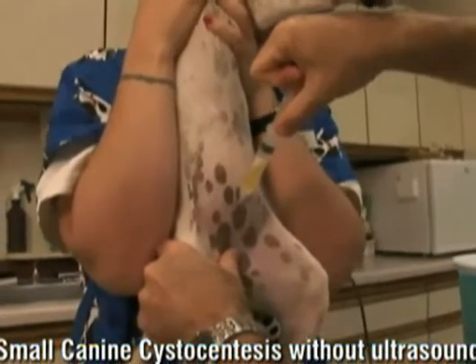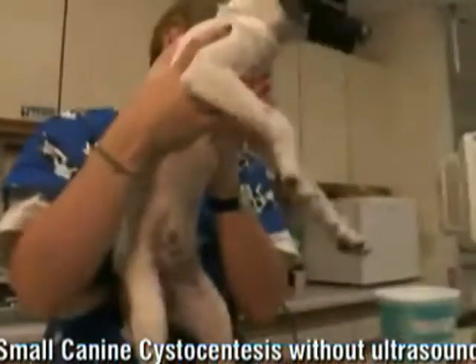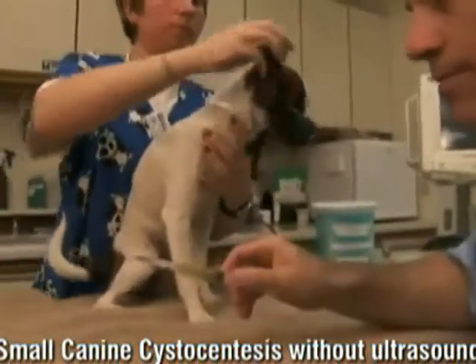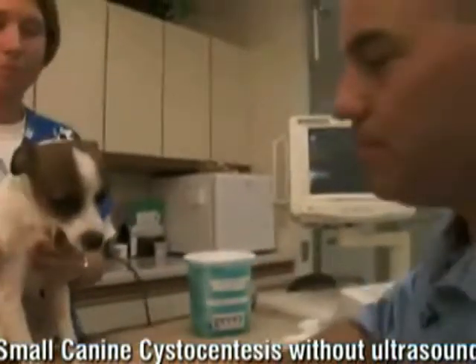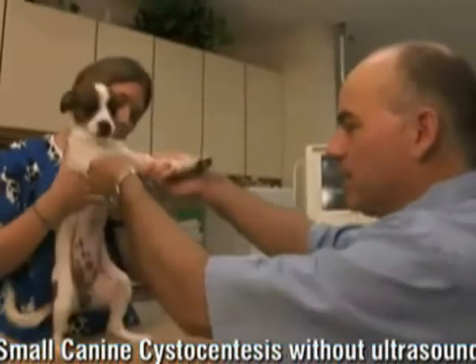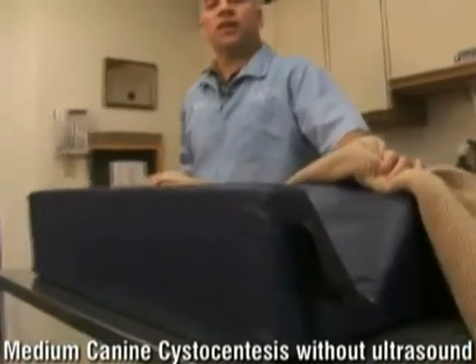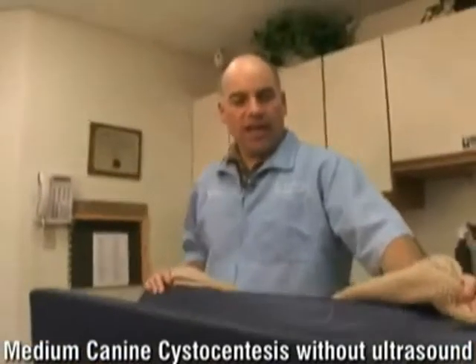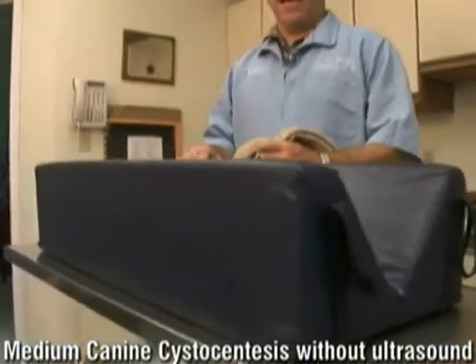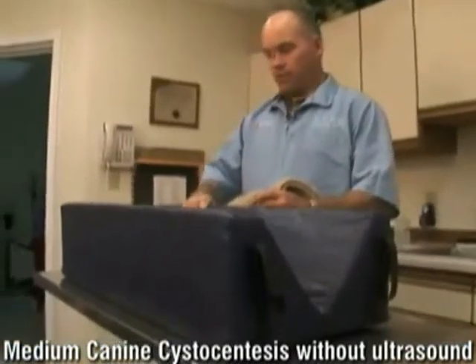If you can envision, her bladder should be right around in this area. So we're going to go right above the pubis, right in this area, and then do an angle about like this. They're remarkably good, most of them. You can see we muzzled her, which I would if you have any questions. And then we just let her go. We got a real nice cystocentesis — about six milliliters of urine. On smaller dogs without ultrasound, we like to do that elevation with the front legs and let gravity work for us, and that usually works real well.